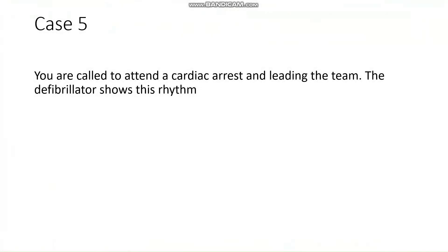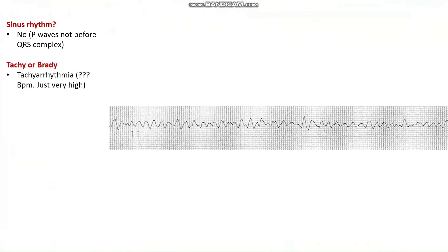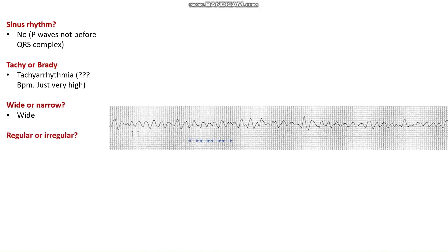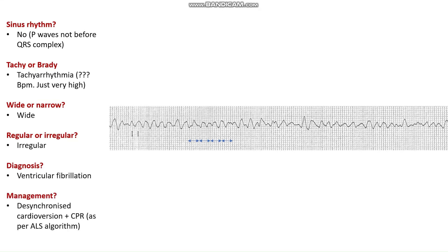Our final scenario: you are the team leader of a cardiac arrest call and the defibrillator shows this rhythm — something we should be able to spot very quickly. Following our algorithm: is it in sinus rhythm? No, we can't make out any P-waves. Is it tachy or brady? Clearly very tachy — we can't even work out how quickly it's going, we just know it's very fast. Is it wide or narrow complex? Clearly wide complex. Is it regular or irregular? Very irregular — we can't even work out where one QRS ends and the next begins. So we have an irregular, wide complex tachyarrhythmia with no discernible P-waves — the most likely diagnosis is ventricular fibrillation. Following the ALS algorithm, we give a desynchronised shock and continue with CPR.